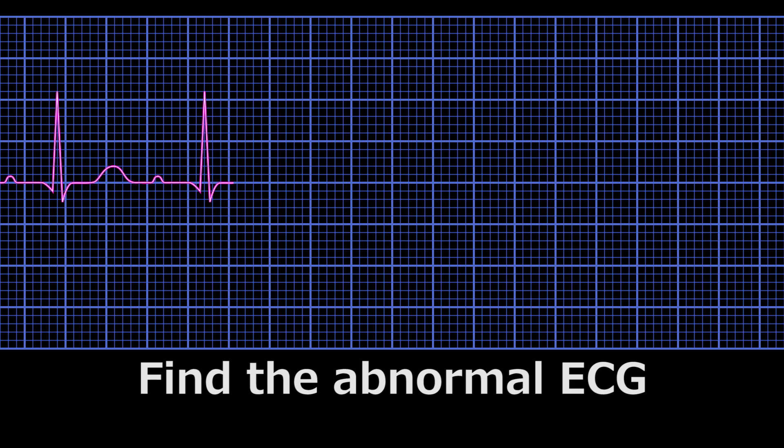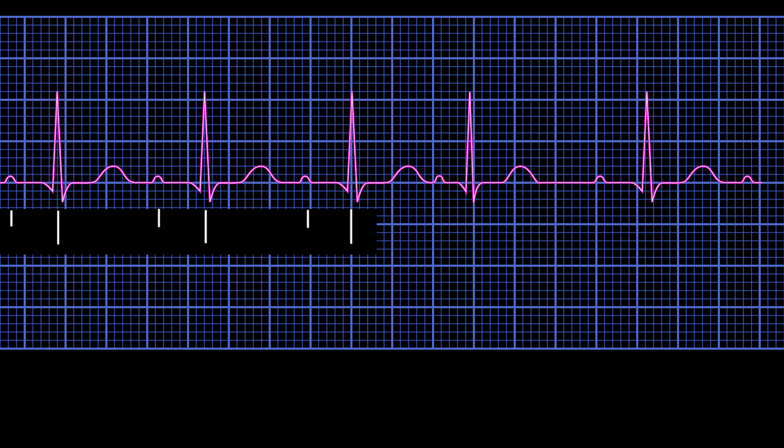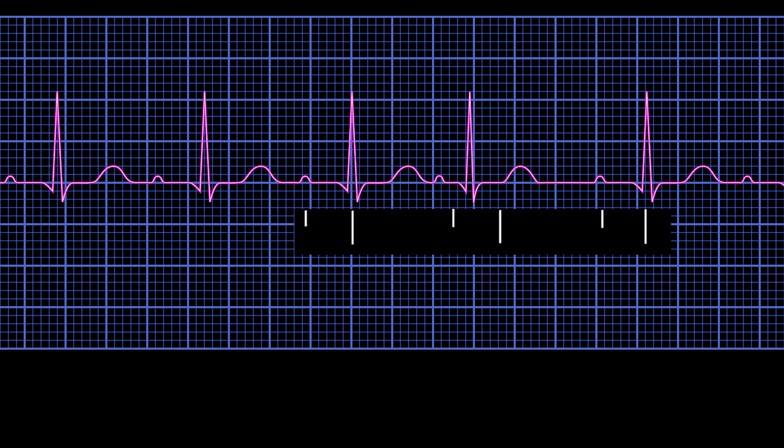An abnormal ECG shows where the rhythm is off, and is used to diagnose where the abnormality in electrical current has occurred.